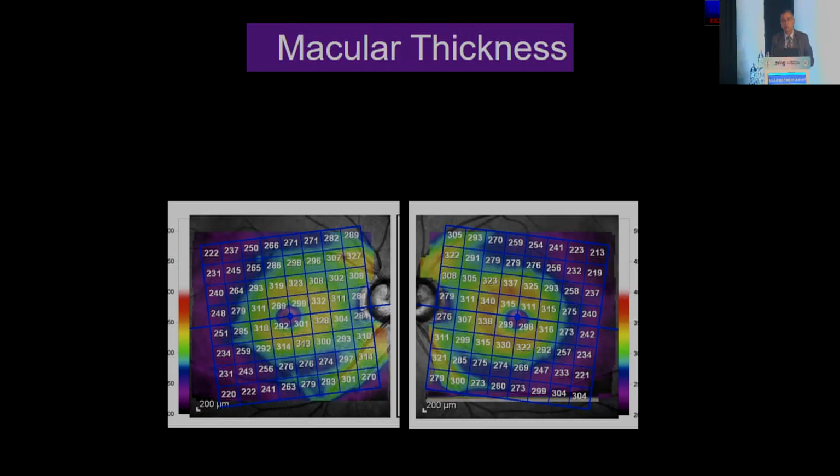So the total retinal thickness is a perfect surrogate measure of the loss of tissue. And besides the loss that occurs with optic atrophy and many other cases that I showed yesterday, glaucoma is the predominant cause of loss of retinal thickness. So we did not have a normative database when we created this thickness map. We had to create this thickness map from scratch.